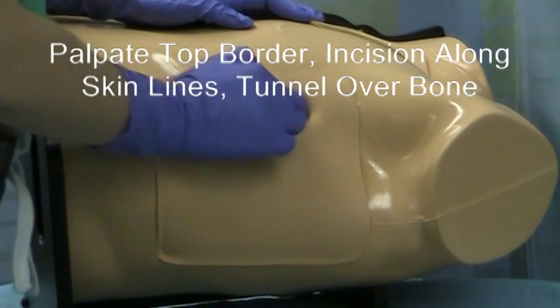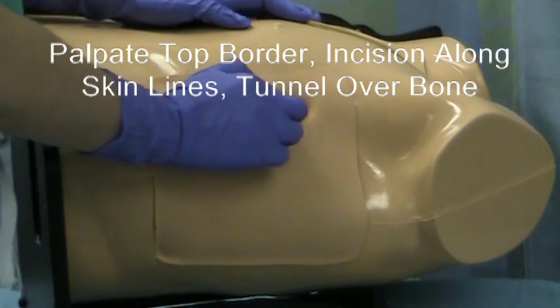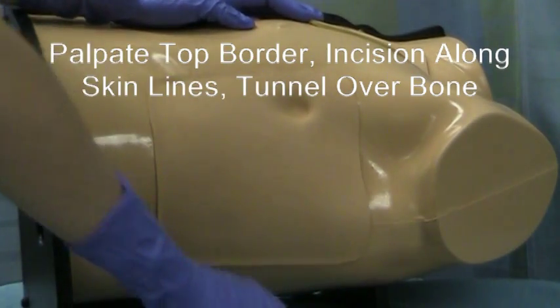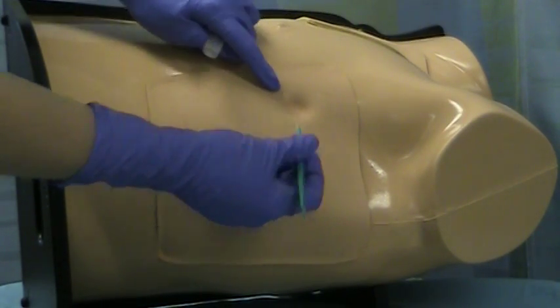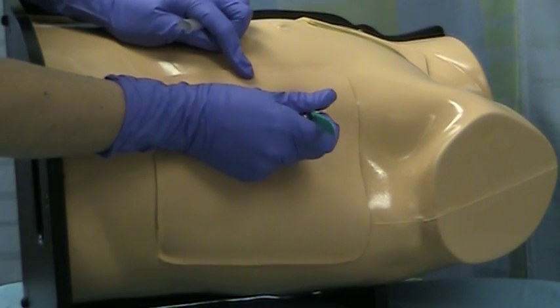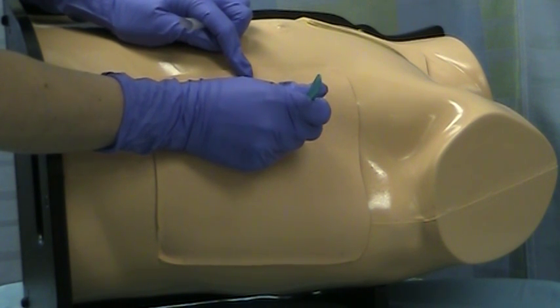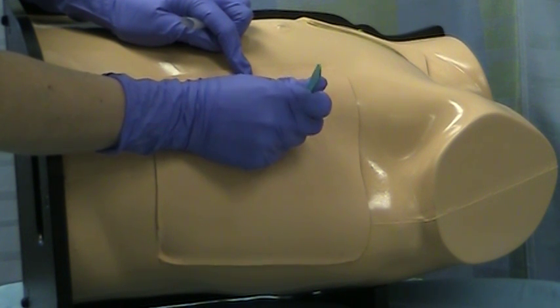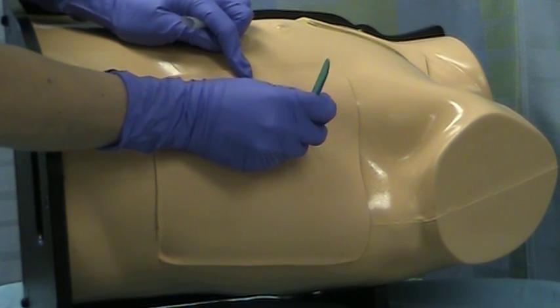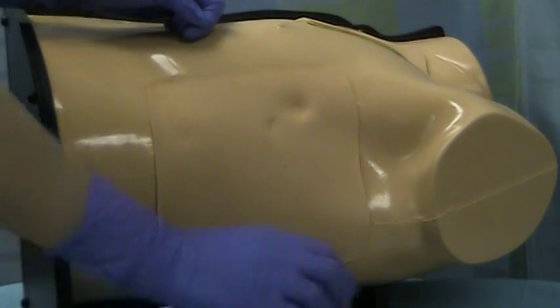In this particular patient, I can feel a rib just there, so I'm going to make my incision literally on top of that rib so that I can tunnel over it. Using my 11 blade, making sure I'm in the anterior axillary line, I go ahead and make an incision down to the bone. I can feel the bone. Now you need to make an incision that's big enough for your tube to get in. It's more important that you make an incision big enough and easy enough to work in than it is to make it small enough that it goes around your tube.